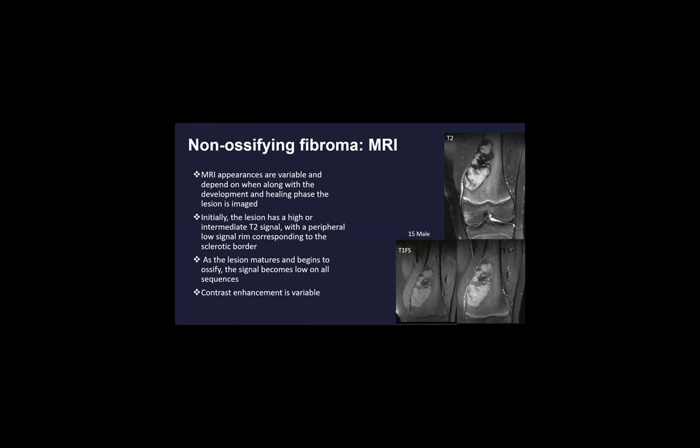And here's a lesion at the bottom, it's a 15-year-old. In the post-contrast, you can see there are areas of enhancement, and the darker areas more centrally are already ossified and healed, so they're not expected to enhance. And this is a T2 weighted fat saturated image showing, again, the lobulated contours, and these darker areas are already healing in this particular patient.